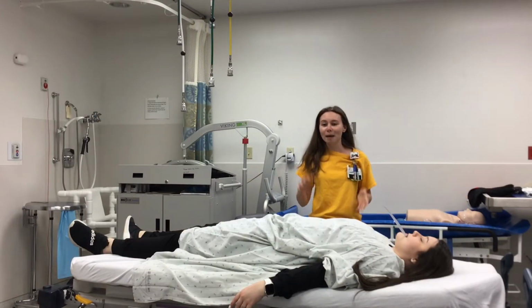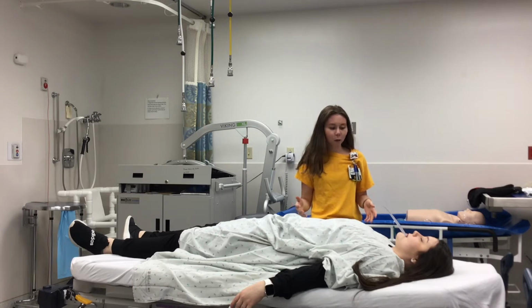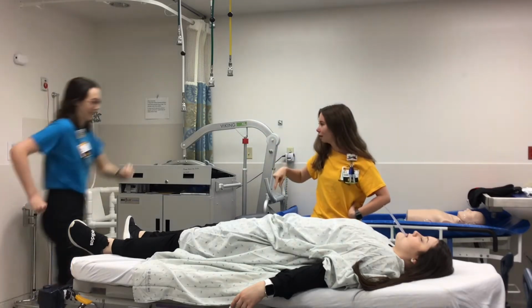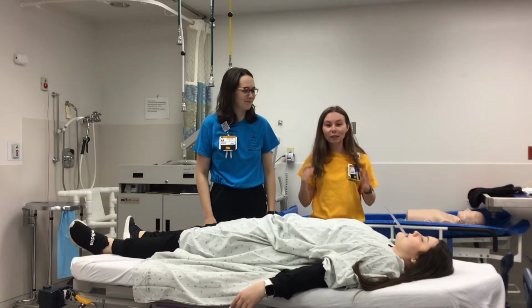Now that pesky code team is gone, let's actually save this patient. So we want to get her set up for the Wound Scout. The first thing I'm going to do is take off all of her clothes, and then I'm going to call for help. So we're going to turn this patient.